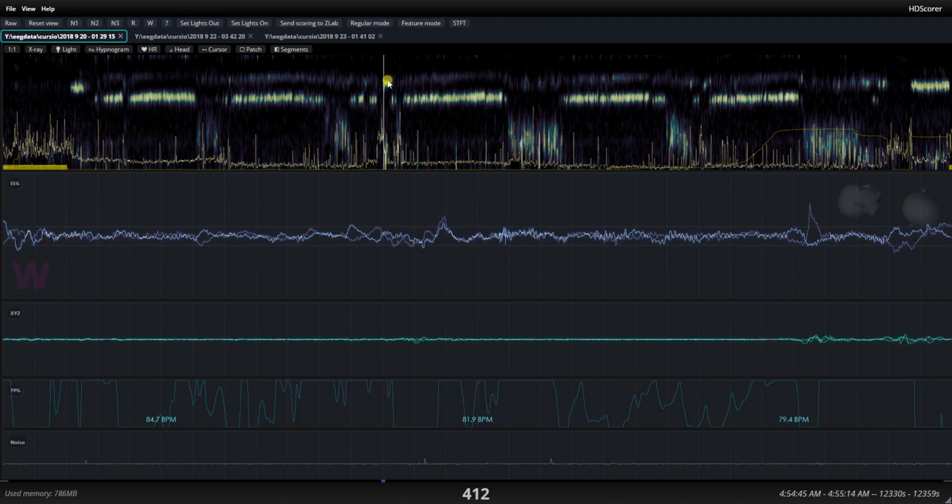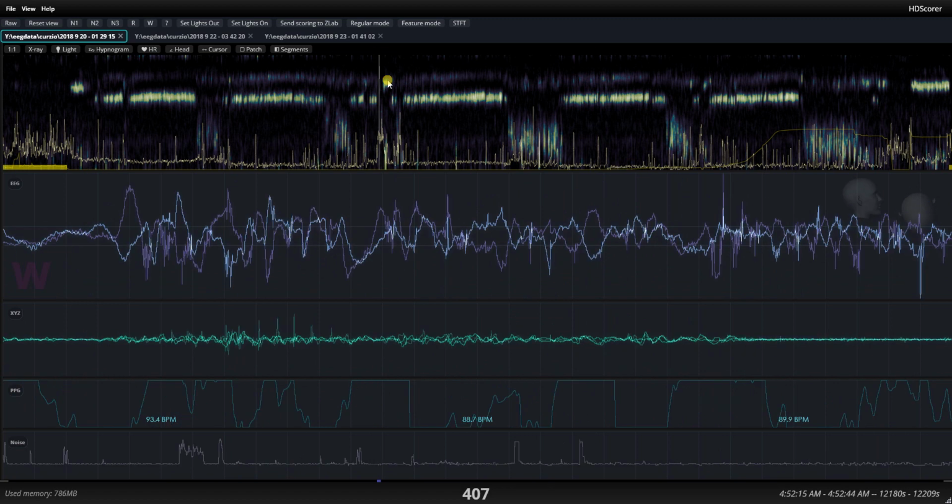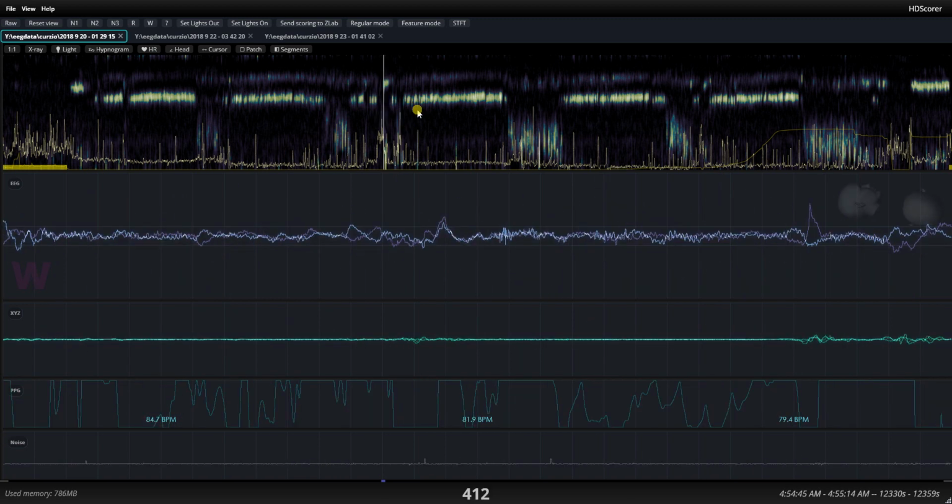I think with a little bit more effort, you could even mark where the wave is not accurate. But since I'm not using the heart rate for any further processing, I haven't really gone far with developing that as well.